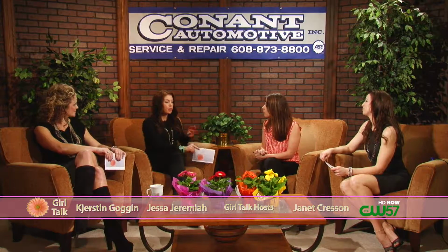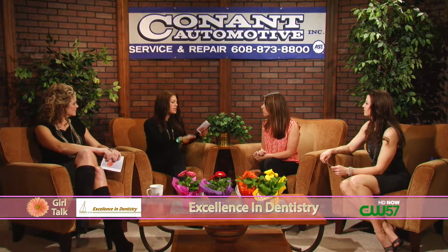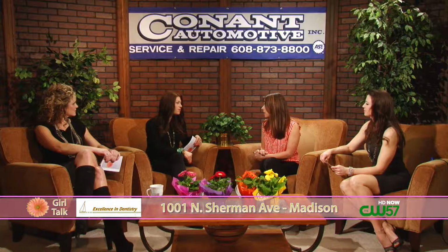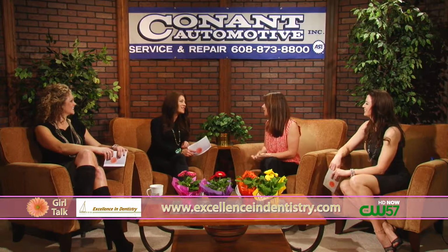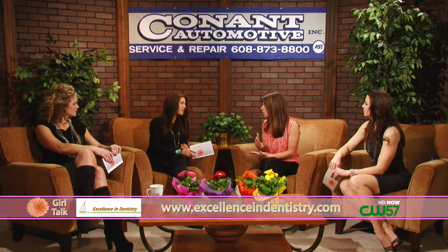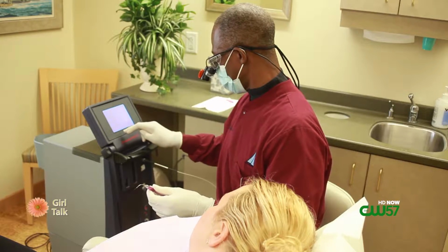I want to go back to lasers because I'm curious about this, because lasers are being utilized in a lot of different fields now. So lasers in dentistry, what do you use them for? Many different things. One of the most exciting things is called Periolase. Periolase is a laser-assisted new attachment procedure. It's used to treat periodontal disease. Okay, I'm going to table that for now because we're going to talk about that at a future meeting. We'll have you back. But that's a very exciting advancement. And then lasers can be used on gum tissue. They can be used for wound healing. They can be used to clean out the sulcus during a periodontal cleaning. So many different things. We actually use lasers to treat cold sores and canker sores.